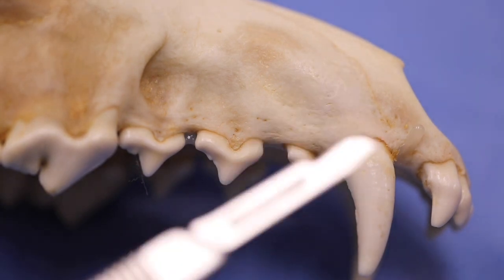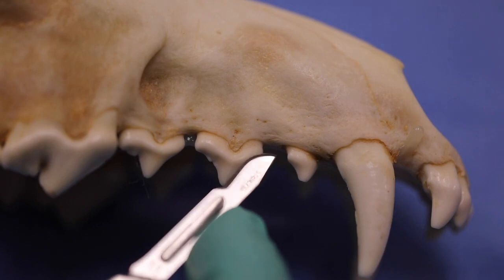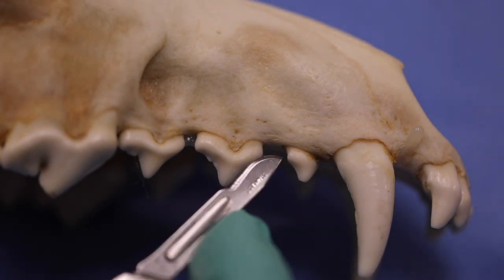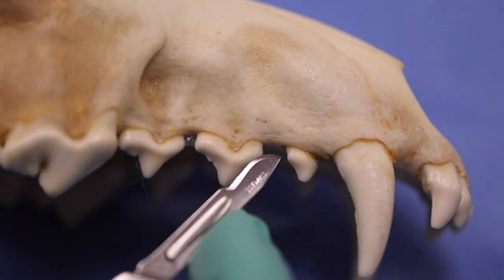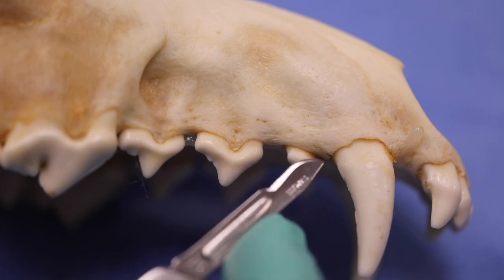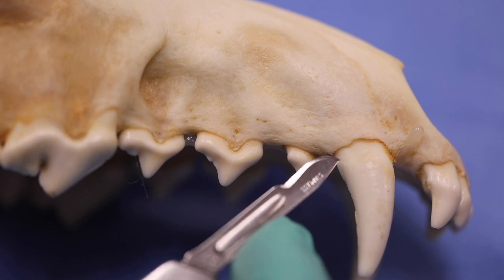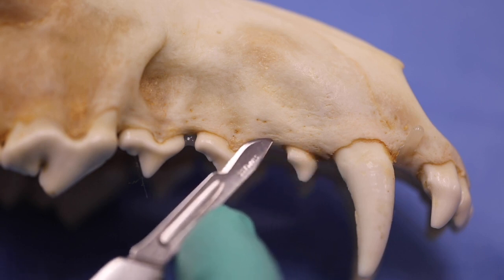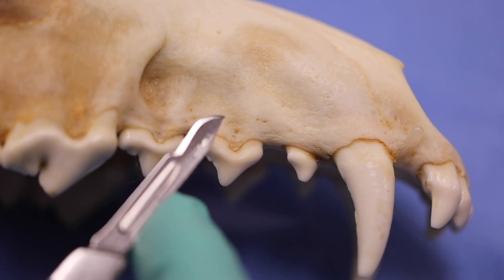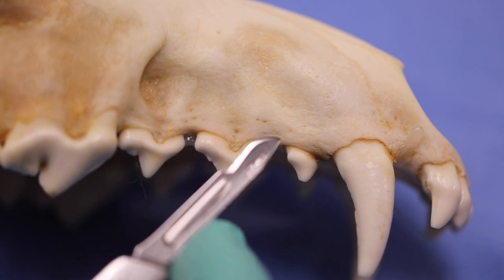One thing that we can't do is have that scalpel parallel to the tooth — and that's the thing that we actually gravitate to naturally. In reality, what happens is it slips off the bone, and we'll rip that flap before we even get our periosteal elevator out to start to elevate.